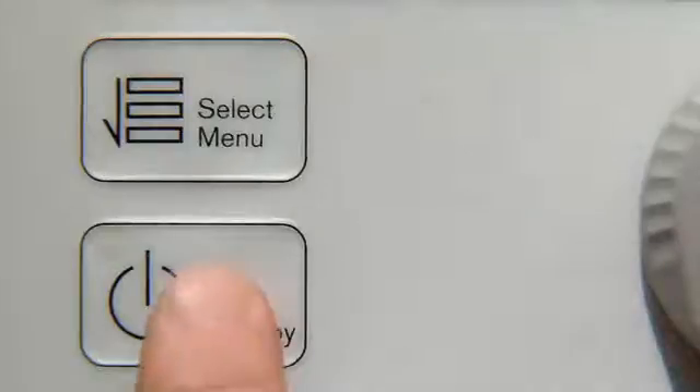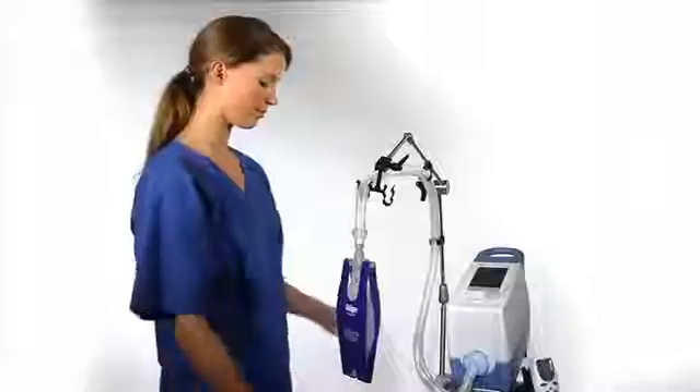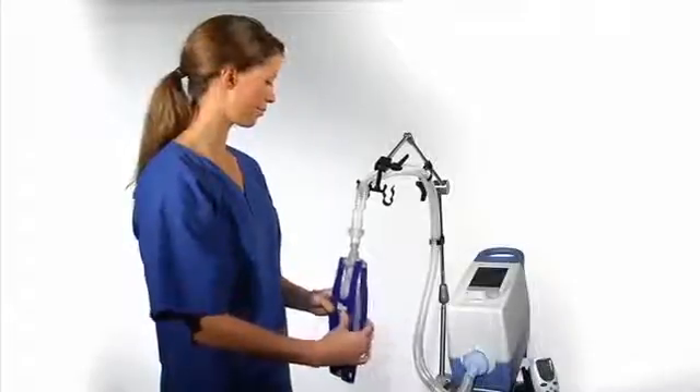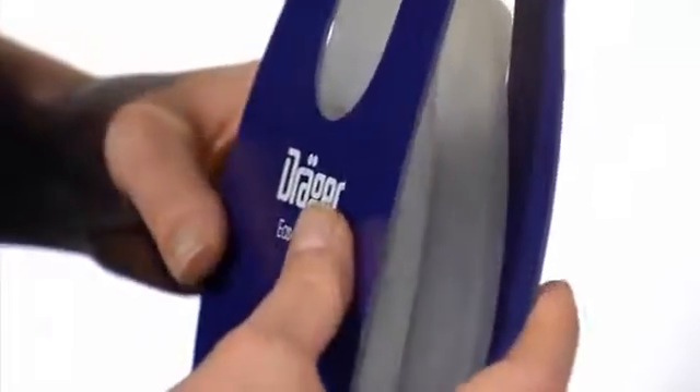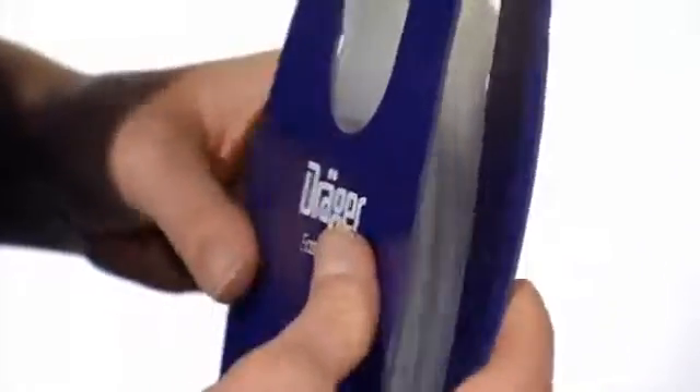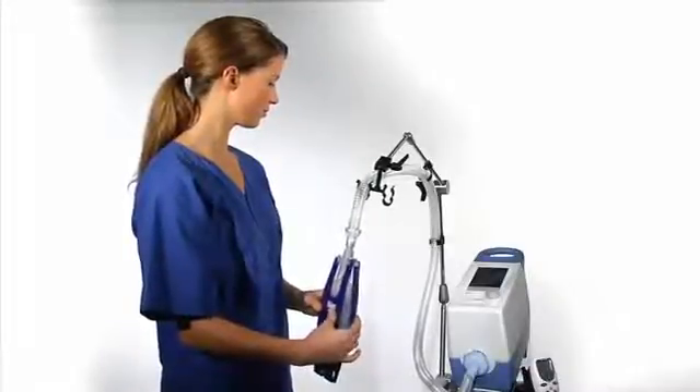Please press the start standby button. Ventilation will now begin. Please compress the test lung. Each time it's compressed, expiration is possible. We call this free breathing. If the patient wishes to exhale, this is possible. This functionality is available for every mode of ventilation.